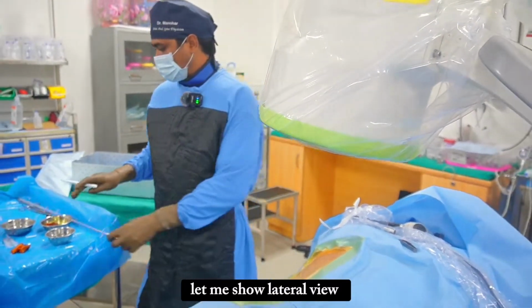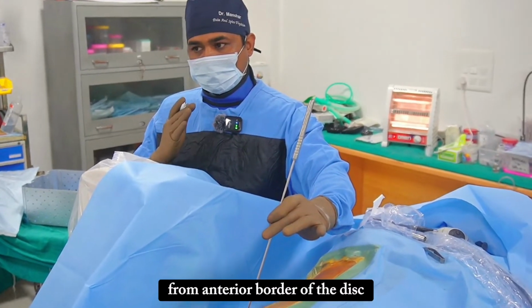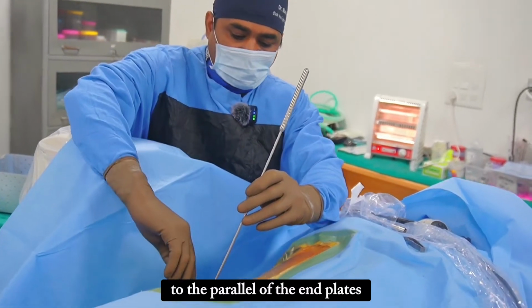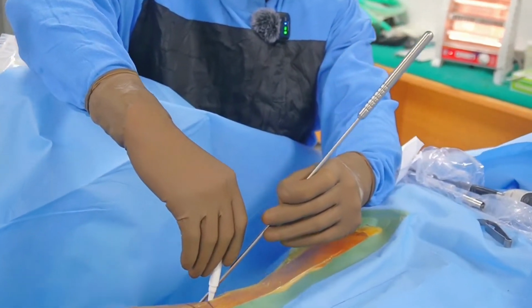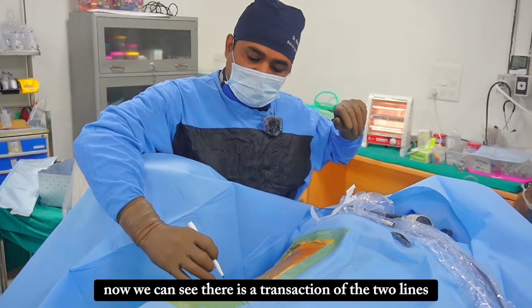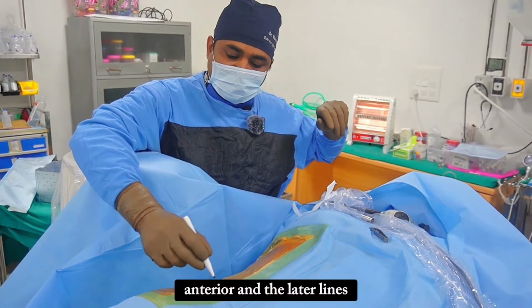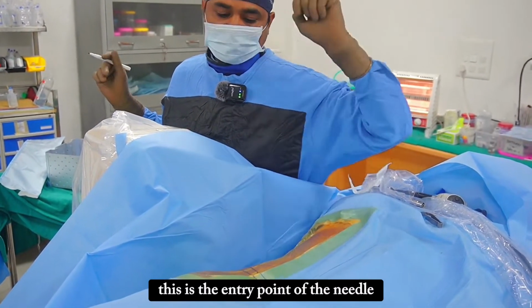Lateral. So this is the marking of the line from the anterior border of the disc, parallel to the end plates. Now we can see there is an intersection of the two lines, anterior and lateral lines. This is the entry point of the needle.